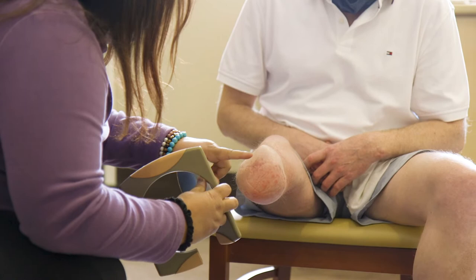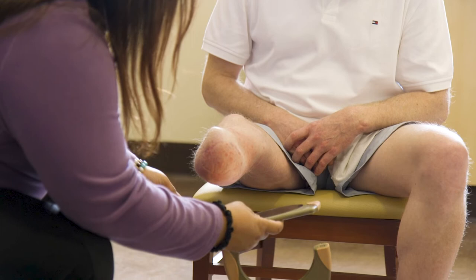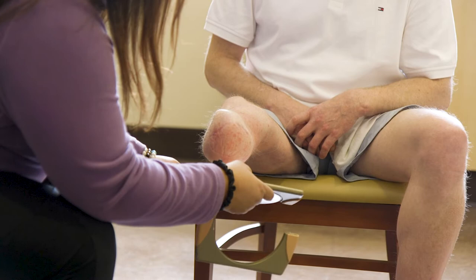Report redness, pain, or discomfort. Let your rehab team know if you feel pain. This can indicate a problem with the fit of your prosthesis and may affect your balance, skin health, or your back.